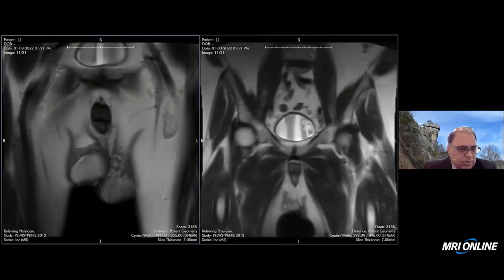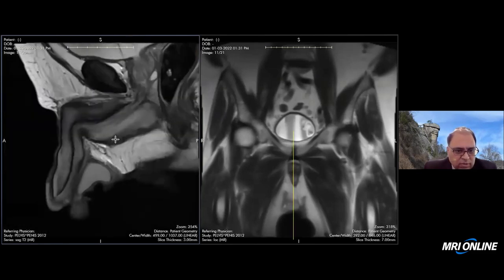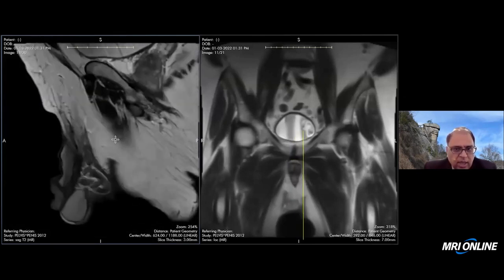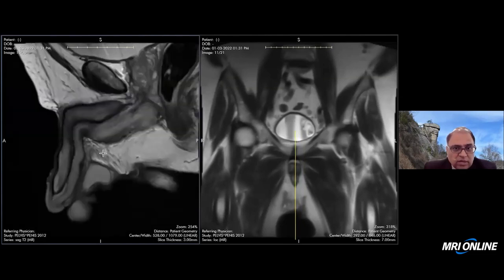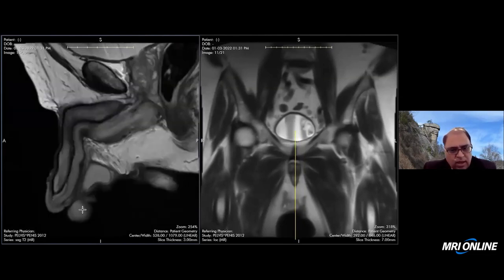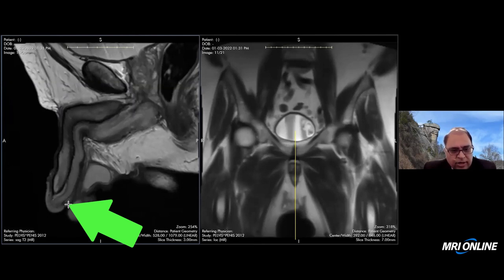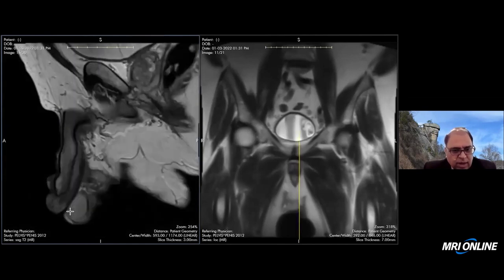What we do here is simply switch to sagittal as usual and try to find the tumor. The patient has already undergone biopsy and is a known case of carcinoma in situ. Along the glans, we see some irregularity in this location and some T2-weighted hypointensity. There is irregularity on the surface here — that is the only area which is catching my eye.